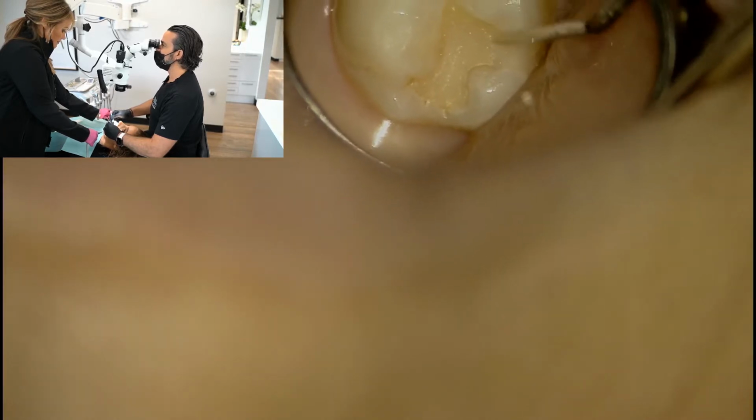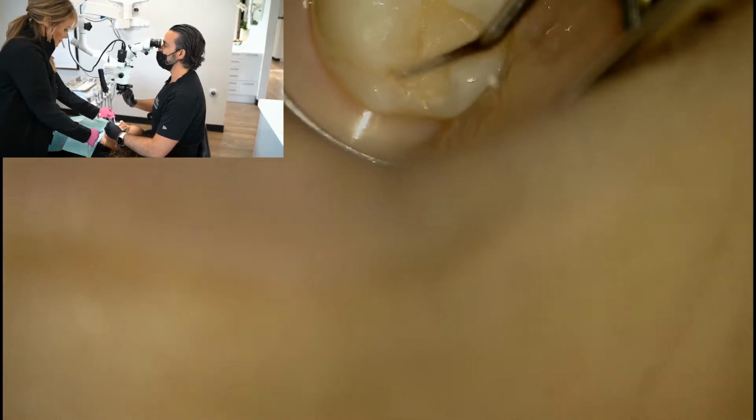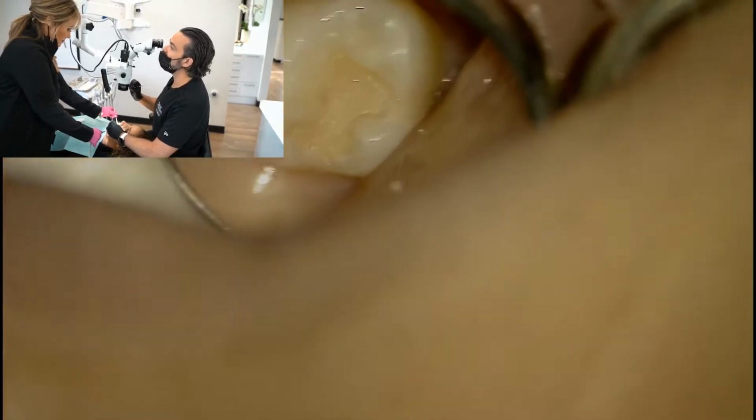One of the nice things too is letting your staff and your patients sometimes see your eye, what you see. It's kind of really nice to explain things.